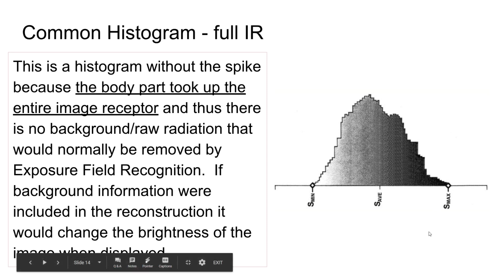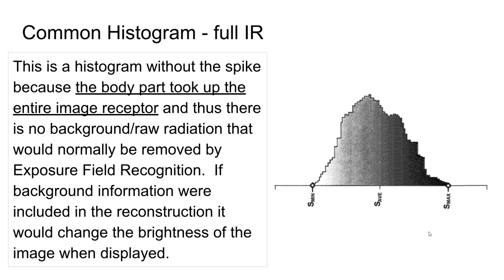This is a better starting point before you even get to that comparison between your histogram versus the lookup table histogram. It's kind of like we need to fix your histogram first before we even allow it to be compared to what is thought of as the optimal contrast brightness based on the lookup table.